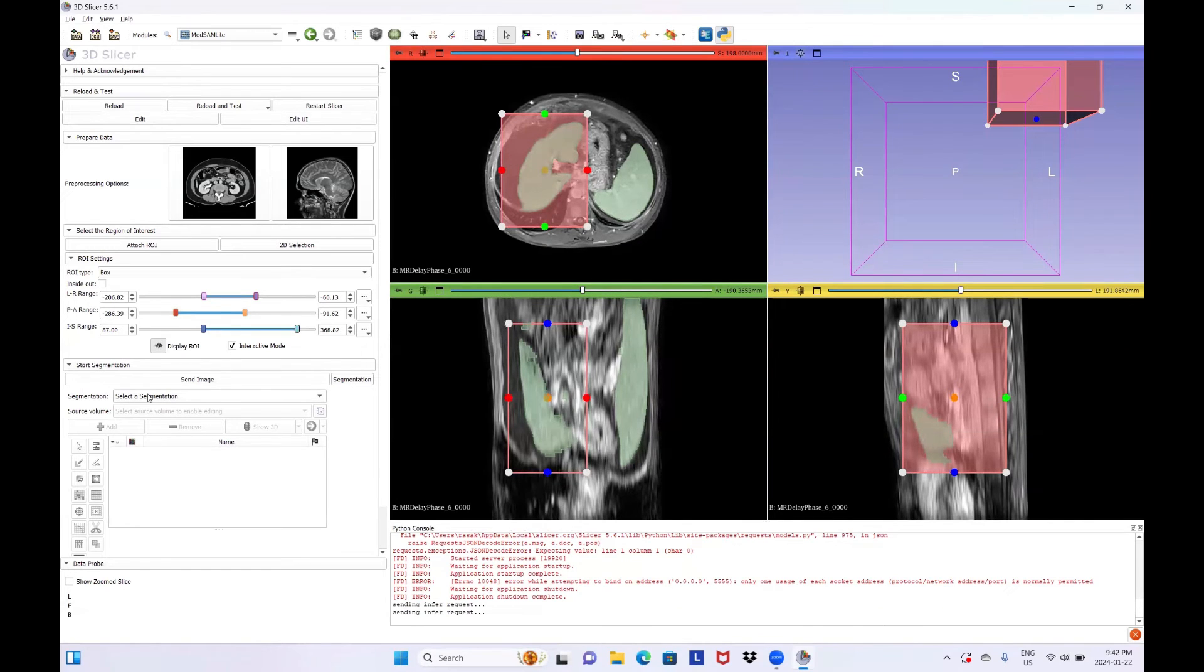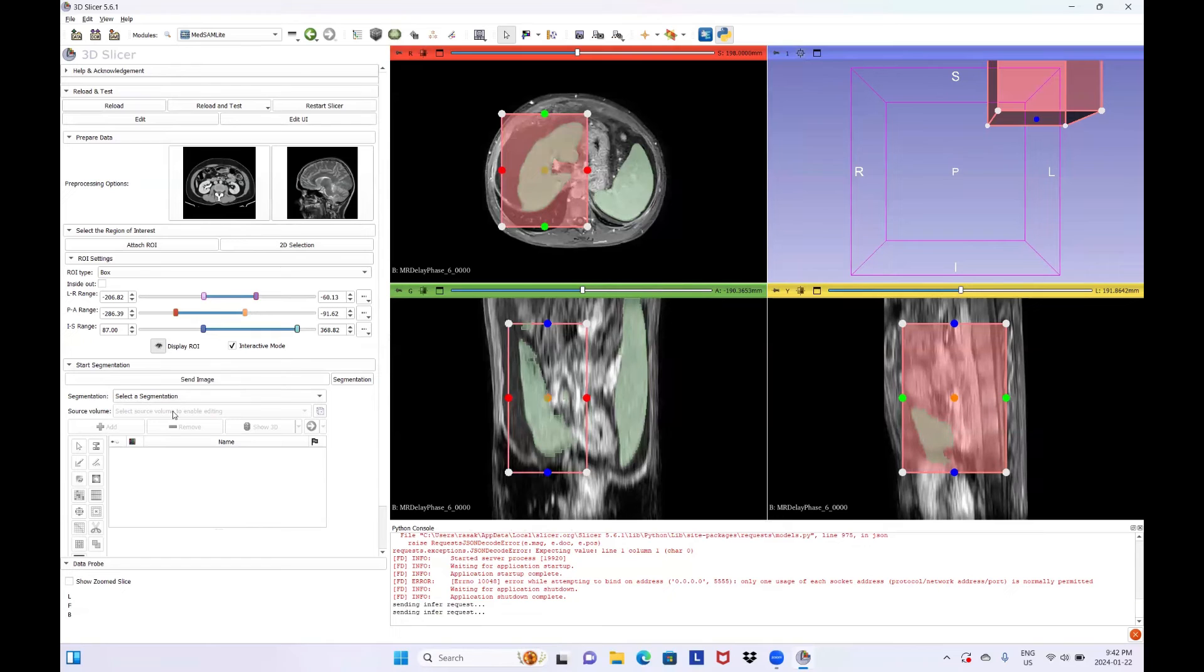In the same section from the Segmentation and Source Volume drop-down menus, you can choose the right segmentation group and manually refine the segmentation results.